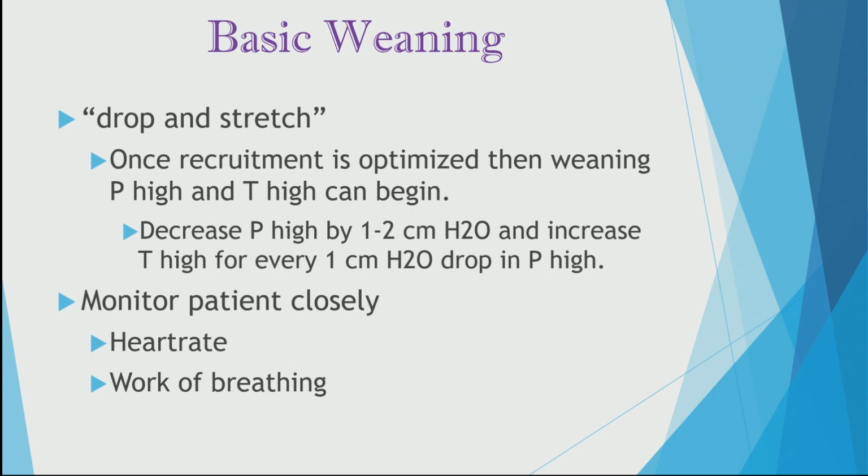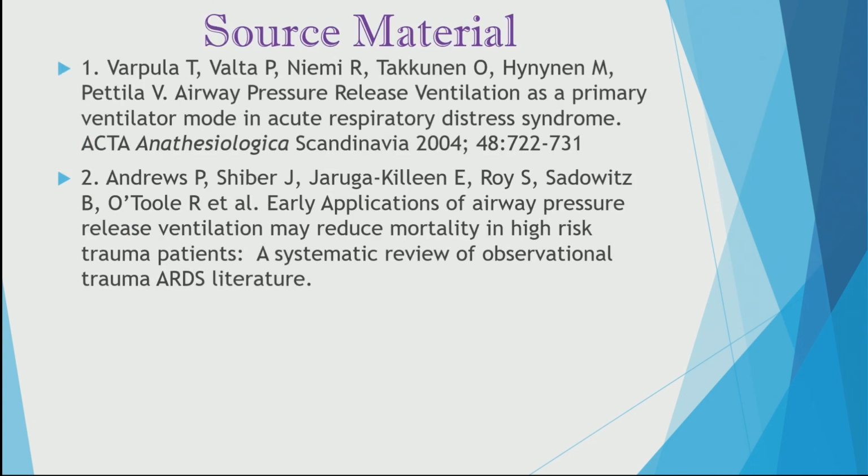And I cannot stress this enough, over and over. Please look at your patient. Don't get lost in the data. Monitor their work of breathing. Monitor their heart rate. Look at their blood pressure. Look at your patient. So, basically, there you have it. Those are some of the source materials that I used. And that's about it. Very simple.